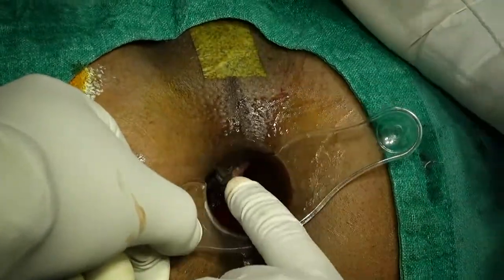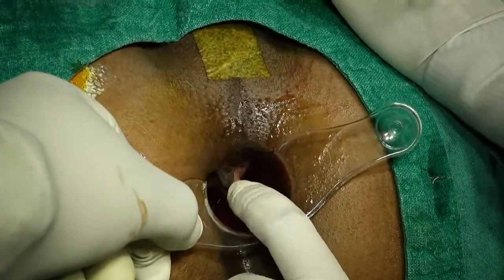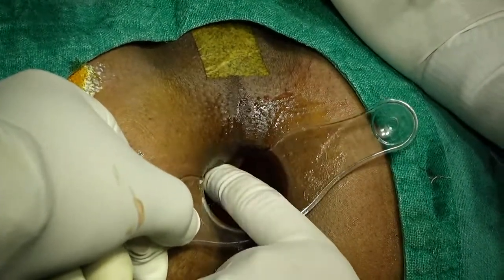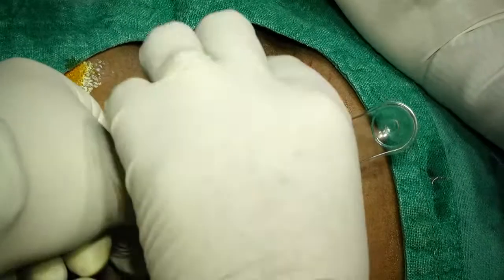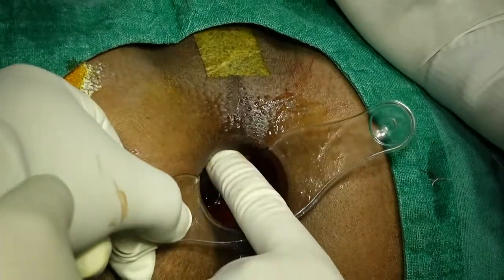This is a bare fiber. I will use the bare fiber. And see that, this is an intersphincteric plane. I can palpate this. And this is the external sphincter. So identification is by the palpation technique.